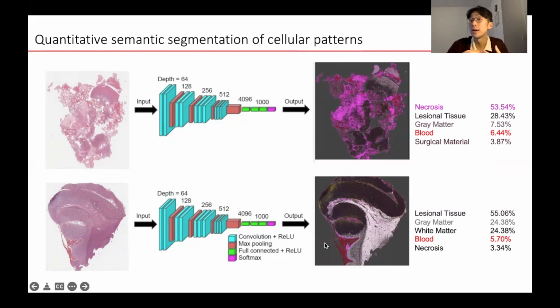And this is great because in the end, ultimately, the most important thing in our analysis is looking at the tumor. Oftentimes the tissue that comes from the biopsy contains artifacts and non-important regions that we're not too interested in, at least not in our analysis. And so this breakdown is important in the next major steps that I'll be discussing, and you'll find out more there.